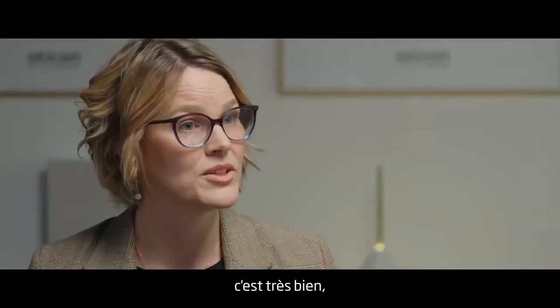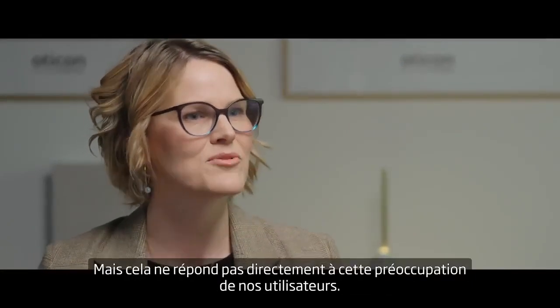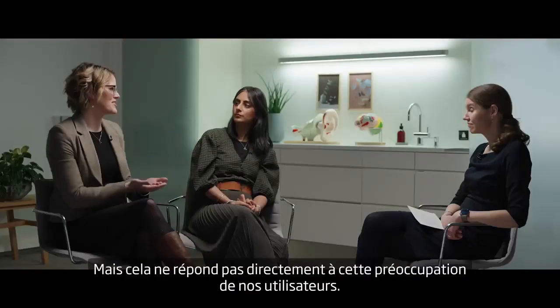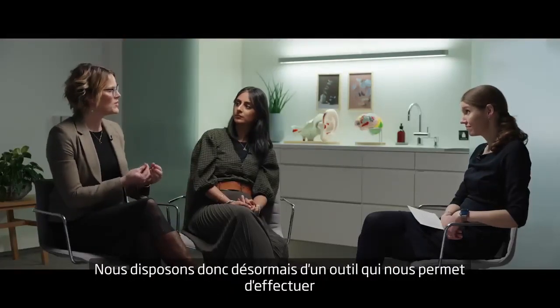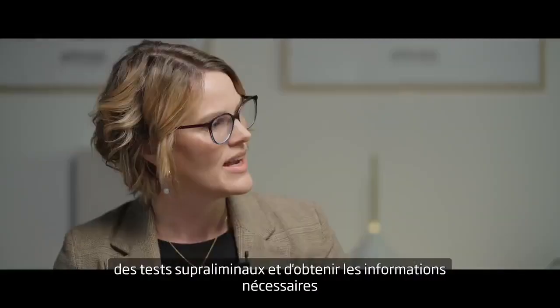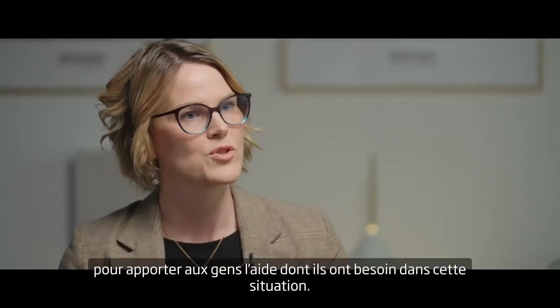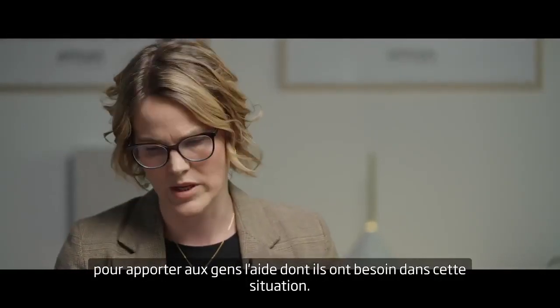And that's all well and good, and it's a very important tool for us to have, but it doesn't directly address this concern that our users have. So we now have a tool that we can use to test above threshold and get that information to give people the amount of help that they need in this situation.